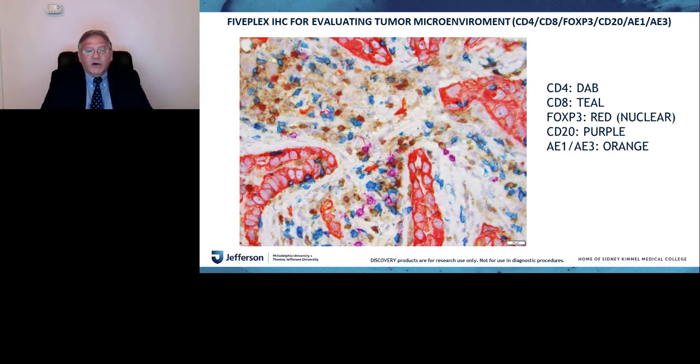If you put the yellow as the last color, it's going to remain yellow. If you put the yellow as your first color on the slide, it's going to turn, after applying everything else, into an orange color.